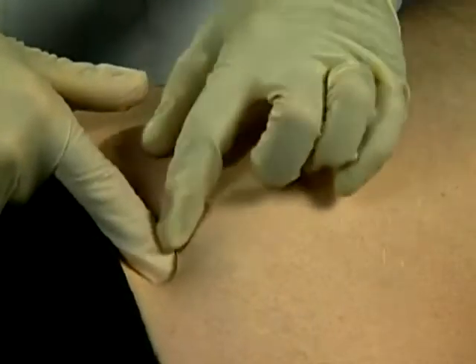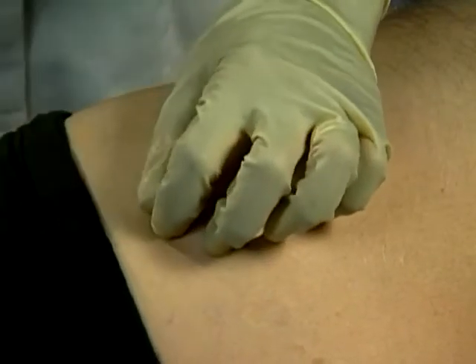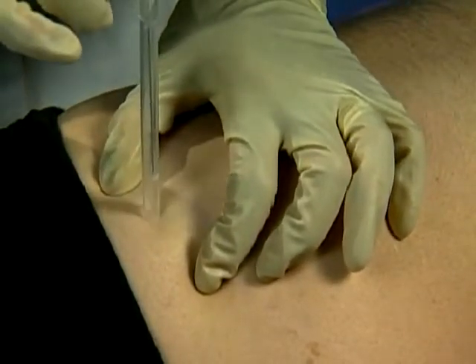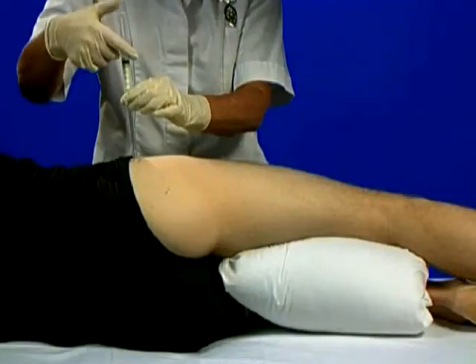Mark entry point here, clean and firmly stretch skin. Rapidly insert a 3 to 4 inch spinal needle perpendicularly. Pass slowly down to gently touch neck of femur, aspirate and inject as a bolus.